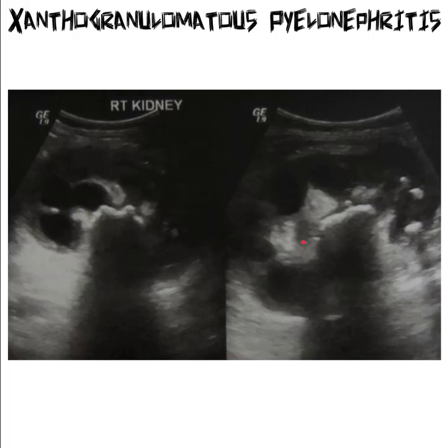In this example, again, we've got fluid out towards the periphery. We're seeing very odd echogenic collections of that granulomatous tissue throughout the kidney. In this image, we can see some fluid backed up. And the big part on this one is the staghorn calculus. What we are seeing right here is the edge of the kidney stone, and then this is all shadowing from that giant stone that is lodged in the renal pelvis.